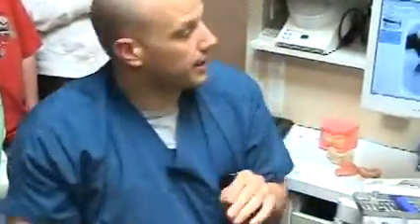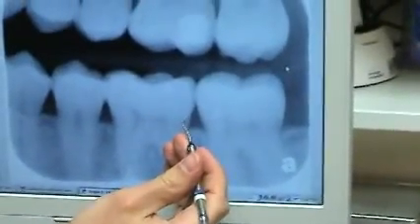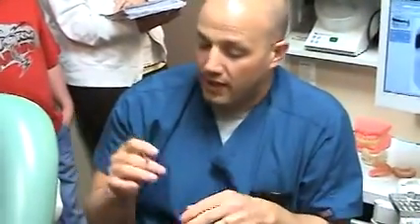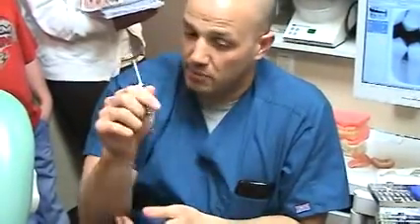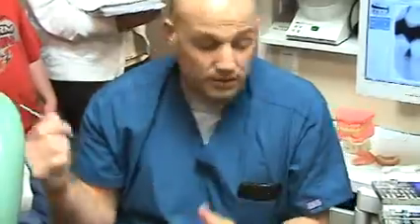Remember there's that little space in your gum tissues in between the tooth and the gum. When I do a crown preparation, usually I'm going to prepare it a couple millimeters above the height of the bone. In order to record accurately right to where I have prepared, I take a little thin piece of string that's knitted so that I can compress it, and I place it all around the tooth. This is what packs it down in and around there so that it expands the tissues, and then I pull it out and take an impression. So that's what that instrument's used for.